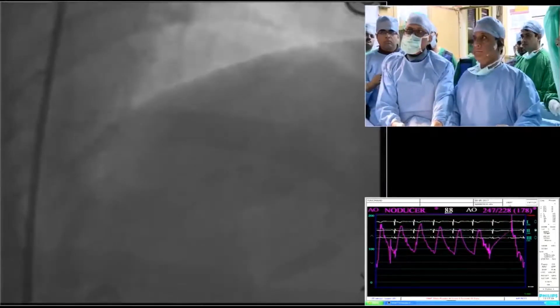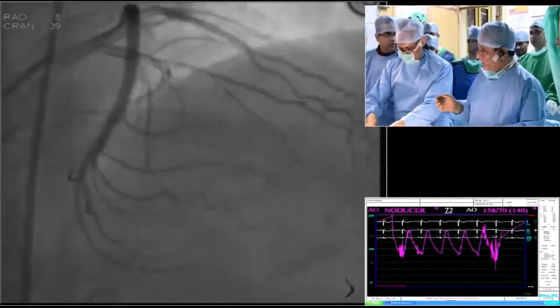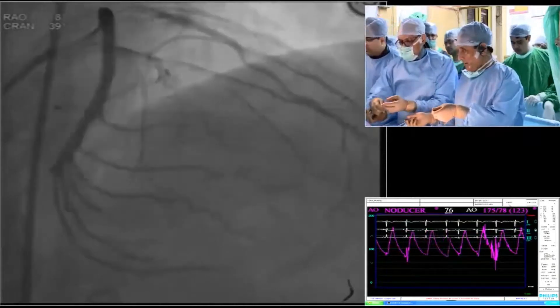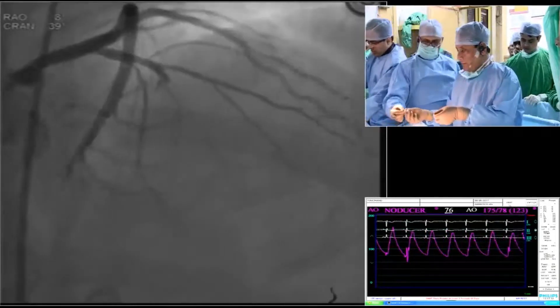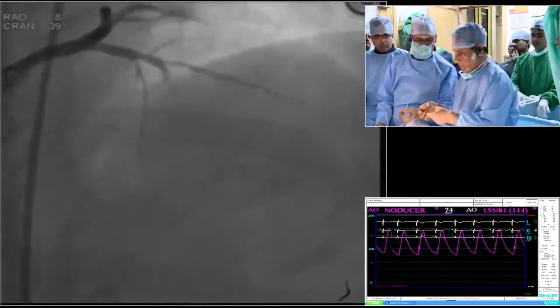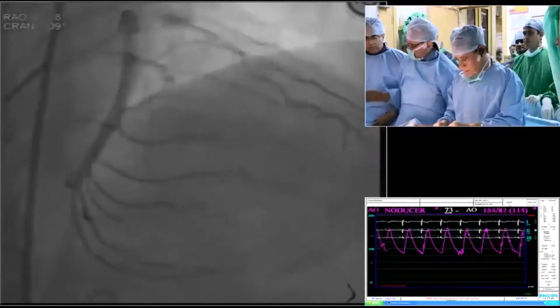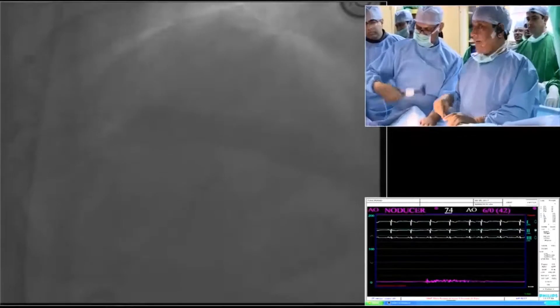I think it's more acutely. Let's take a picture and get a balloon. We are using a 2.5 NC Mosaic. Actually, both Mosaic and NC Mosaic are available in the US also — they are distributed by Cordis. And we are ready with the IVUS also. We were actually looking for OCT but could not make it available, so we are going to use IVUS today.